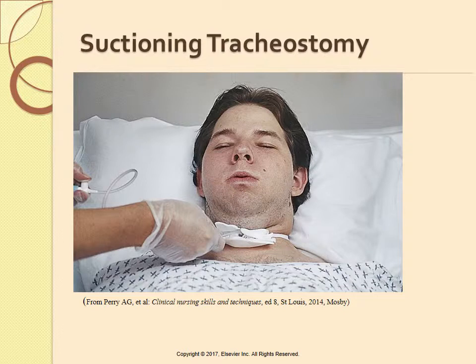Apply suction intermittently while withdrawing the catheter in a rotating manner. If secretion volume is large, apply suction continuously. Suction should be applied for as short an amount of time as possible to minimize decreases in arterial oxygenation levels. Limit suction time to 10 seconds.